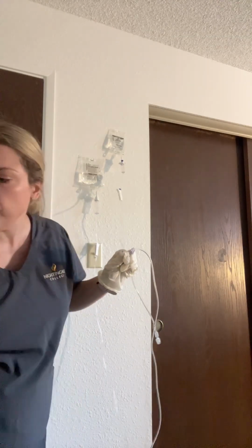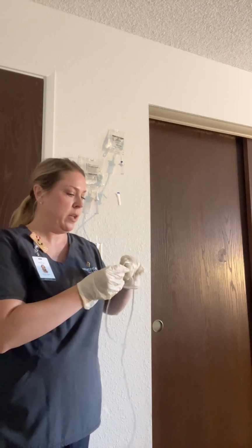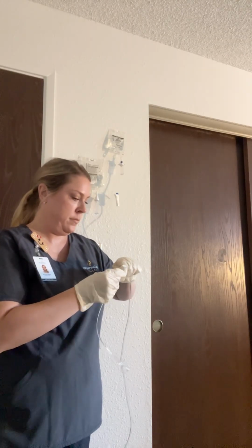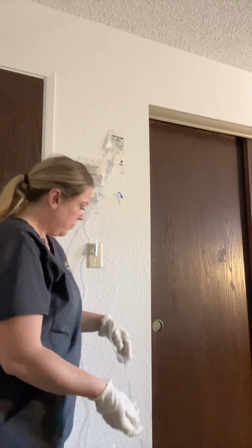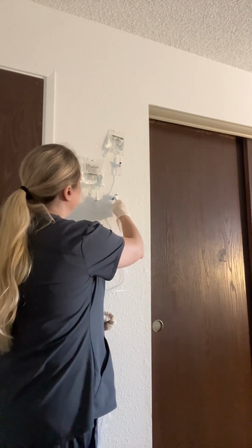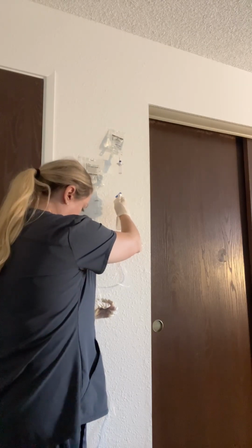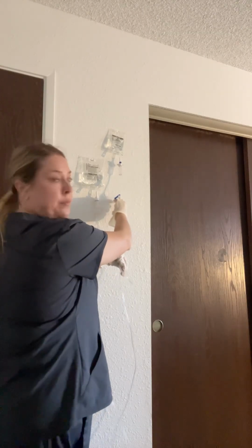Okay, now we want to attach our adapter onto the secondary tubing. All right, all the air bubbles are out. So we want to go ahead and make sure that the flow is good, that we have 100 drops per minute. So we're going to go ahead and do that now. And starting now.